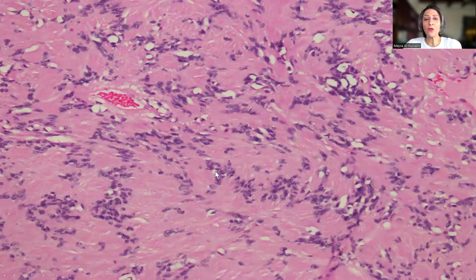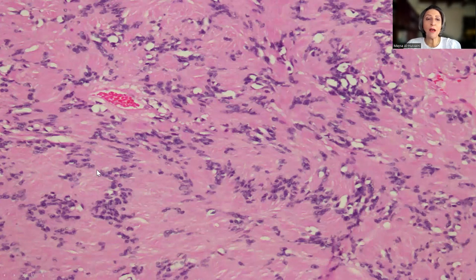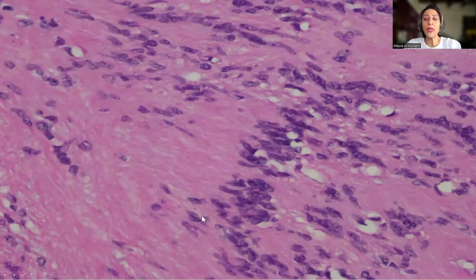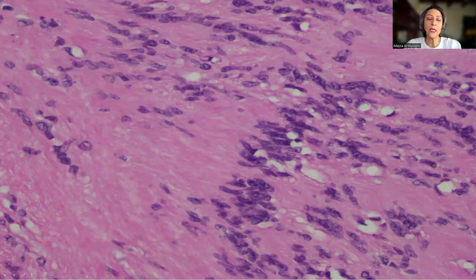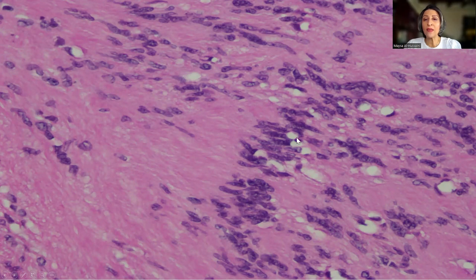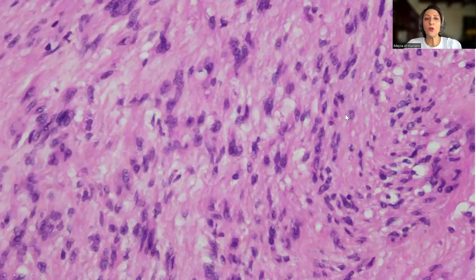Back to the beautiful palisades where we have the palisading of the nuclei, and then we have the fibrillary hypocellular areas in between. Another high-power magnification shows the fibrillarity commonly encountered in neuronal tumors, along with the palisading of the nuclei.